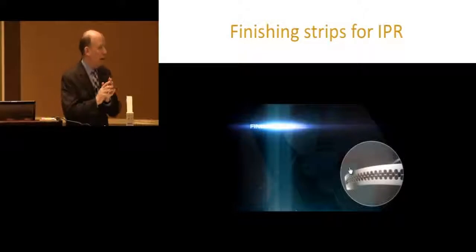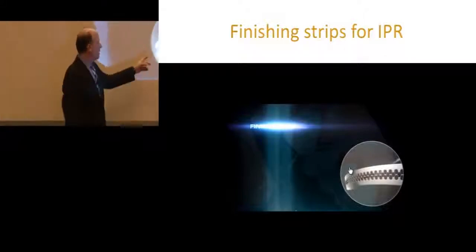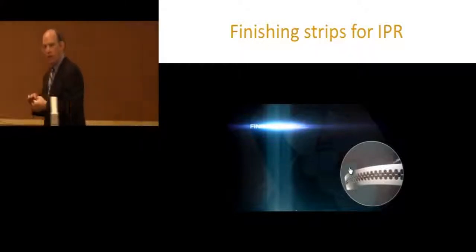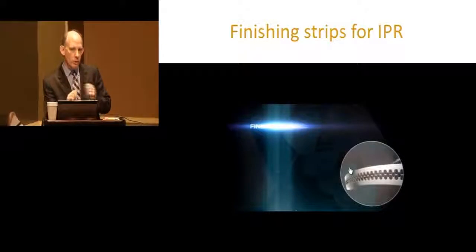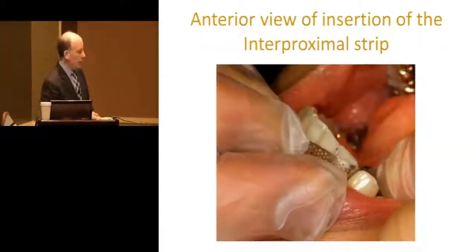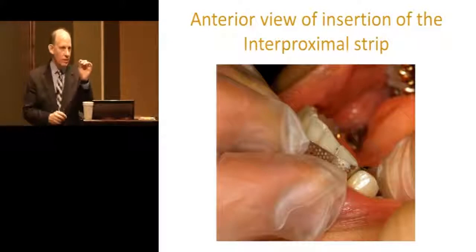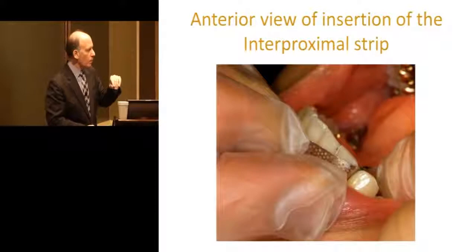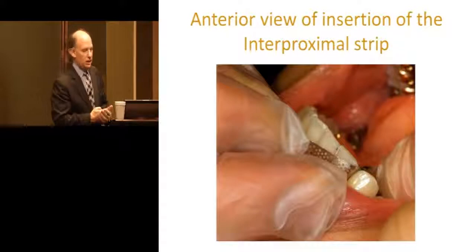And again, any real product has these polka dots, like I said, and what they're doing is carrying away the dust from the enamel. If you don't see those polka dots, it's going to be too stiff, and you won't be able to really contour the way you can with this. Now you'll notice too that this side's the bald side, so you'll be able to see the diamond. It's a little bit lifted on the side where the grit is. So you can really put the safe side up against the canine, and I know I'm not going to get any contouring there.